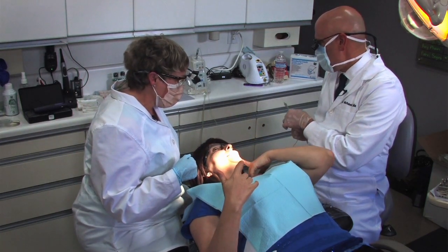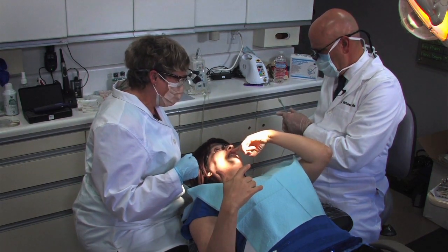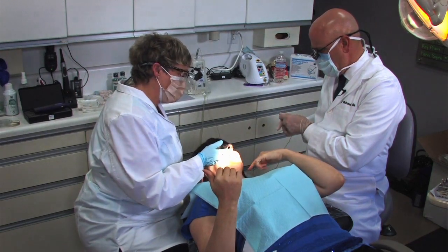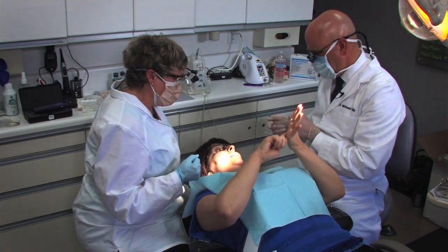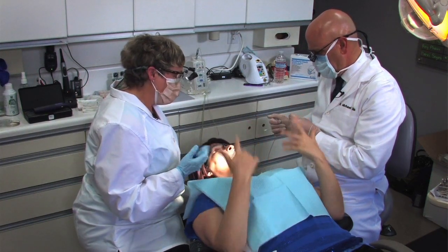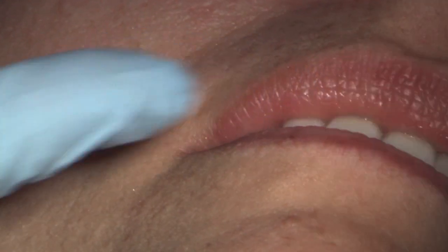What I used to do was PSA, MSA here, and then ASA here, and if you had concern about crossover you'd do an additional infiltration. The greater palatine — palpating to see where the dimple was and aiming for that — with the greater palatine you're not going to get any of the lingual tissues in the anterior.